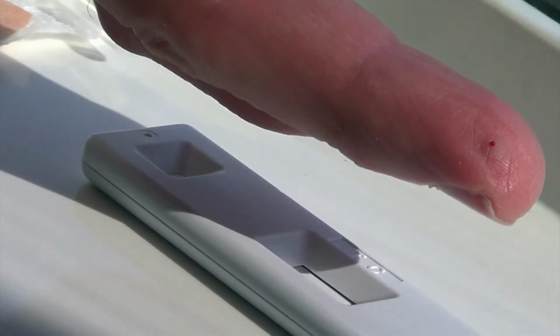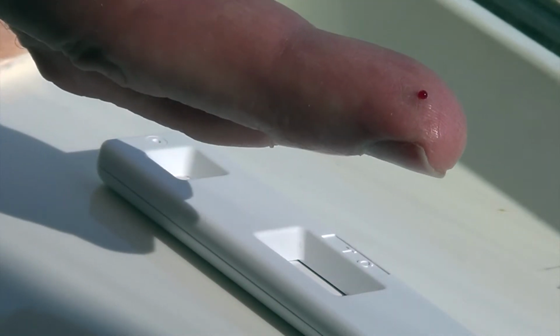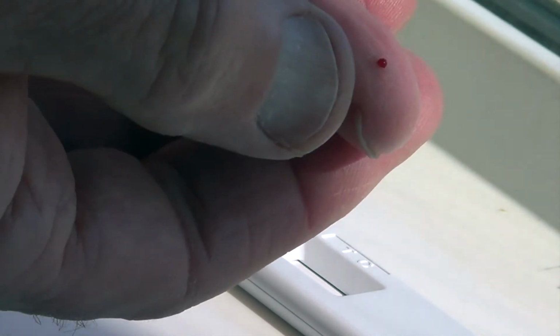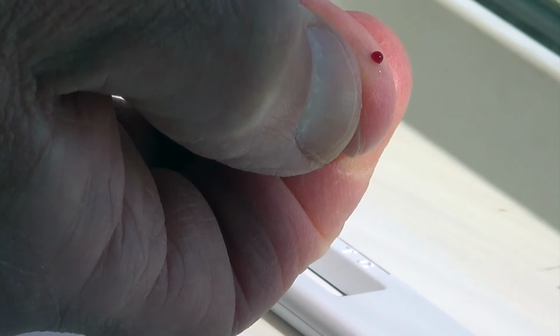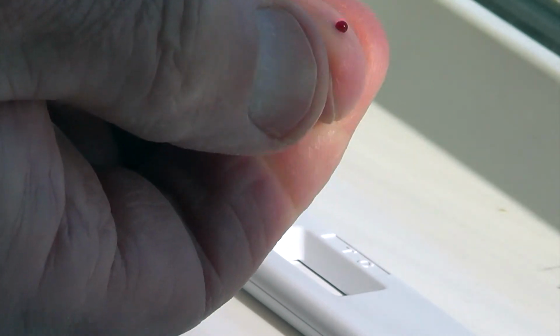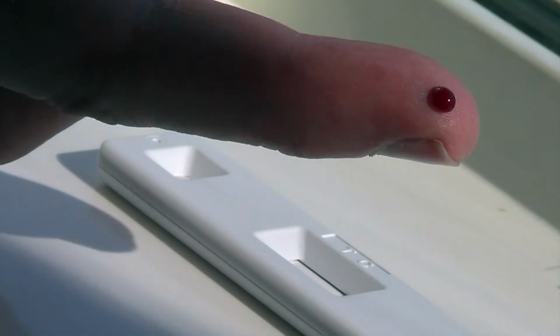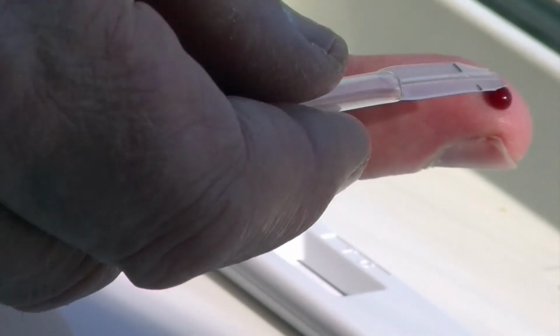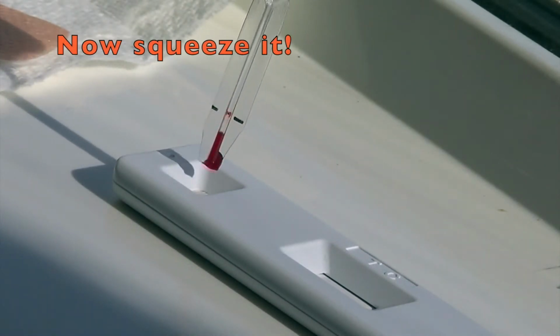And then it should start to produce a bit of blood. And if it's not fast enough, you can squeeze the finger at the edges to help it make its way out. So I'll take the little capillary, it's getting huge now, massive, right, so I just touch this against it and it should run up to the black line as it's done, and I've got plenty spare, like that, okay. And then quickly transfer it to the middle of the test, which is there, by squeezing.